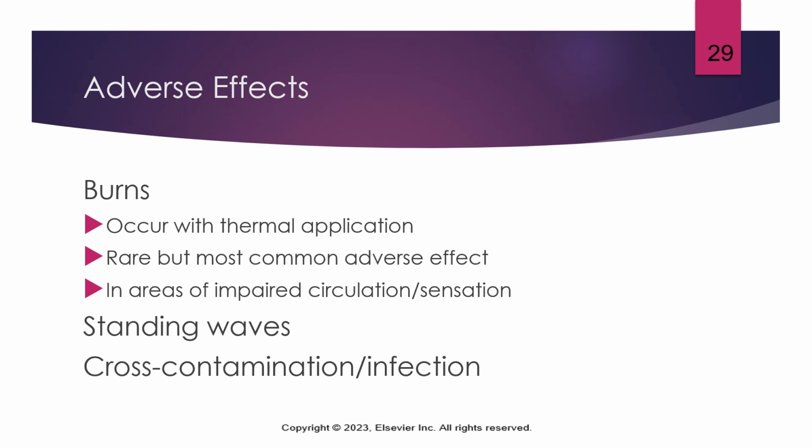Make sure you clean your equipment. We're going to clean it every single time that we use it before we apply it to our patient. We're going to clean it every single time once we're done with the application of ultrasound. But just a rule of thumb, just assume that everything is cross-contaminated already. It's already infected, so we're going to clean all of those different surfaces that are touching our patients, especially if you're going to use it near an open wound. If you're trying to induce soft tissue healing, you want to be really, really cautious there. So take the precautions you need, wash your hands, clean your equipment.